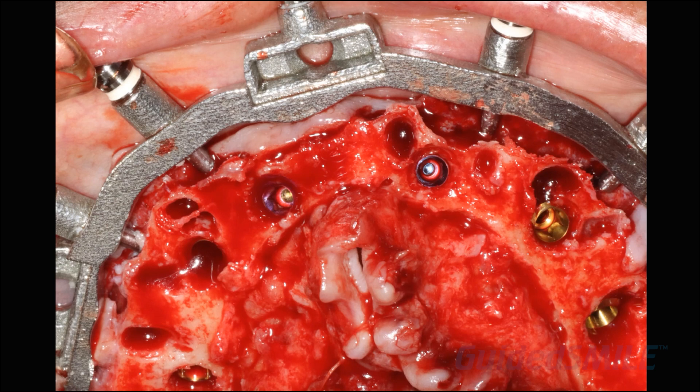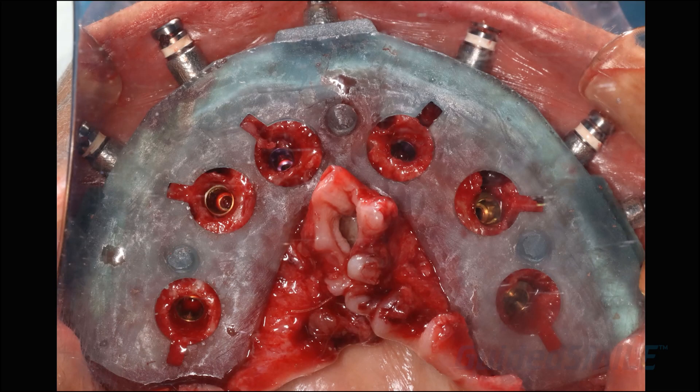The implants are in — you can see they're fairly subcrestal. The doctor performed profiling. This particular doctor puts a cover screw on the implants and then uses a burr to open it up — there are lots of different techniques for bone profiling, but it is absolutely necessary and must be done if you're subcrestal, because the abutment is not going to seat fully otherwise, which is key.